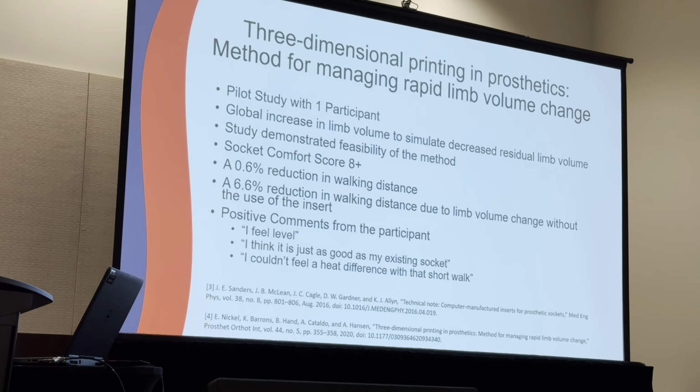And they ran a comparative study between the loose-fitting socket, the well-fitting socket, and the loose-fitting socket with the insert integrated inside. The participants reported back a lot of positive feedback. You can see here that they had a socket comfort score of over 8, and they had many positive comments such as, I feel level, I think it's just as good as my existing socket, and I couldn't feel a heat difference in the short walk that they took.